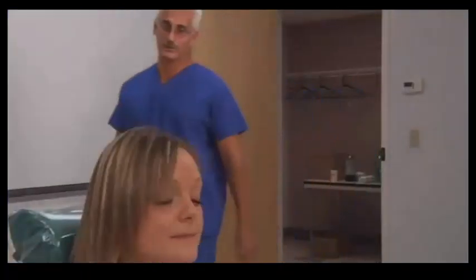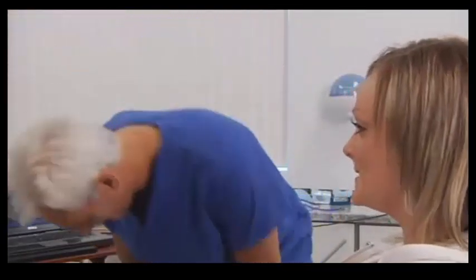Good morning, Caroline. How are you? Hi, Dr. Kirstein. I'm good, thank you. Good to see you. Good to see you too. Today, what we're going to do is measure up your occlusion with the T-Scan and see the quality of your occlusion and disclusion. But before we do that, I'd like you to tell me about your symptoms, what you've been feeling, how long you've been having these problems.